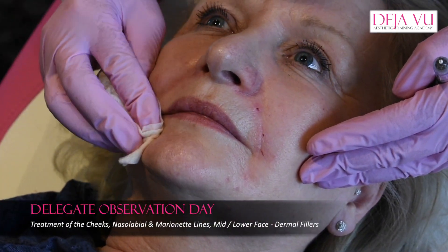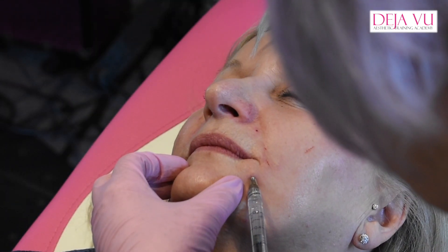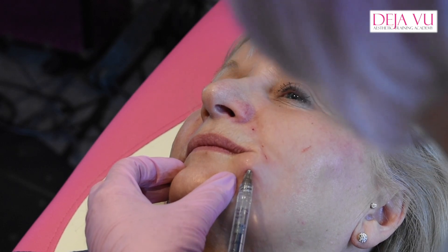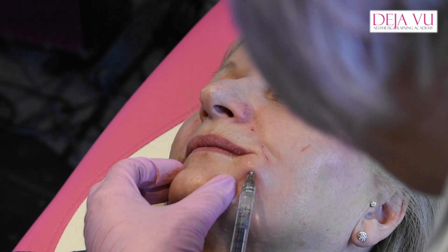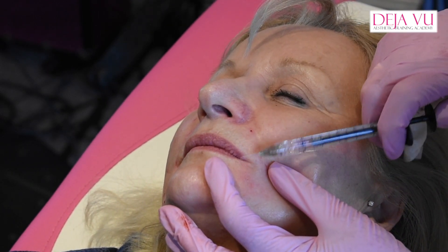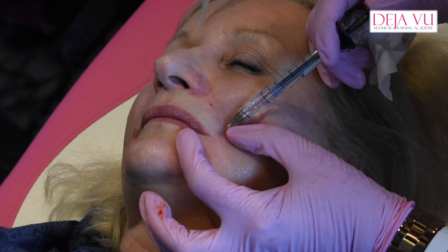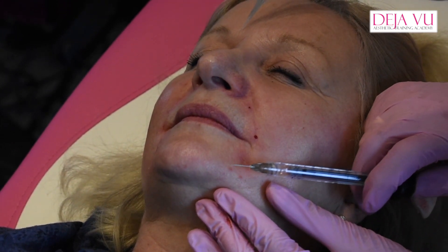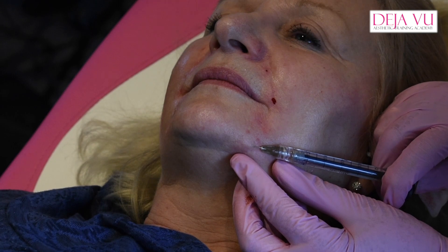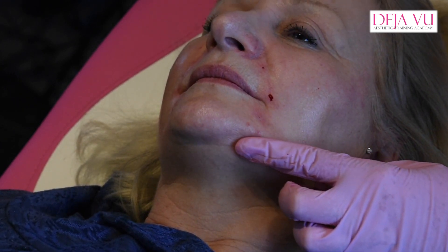Turn it down for me. I can see from this angle that that side's dipping in quite a lot, and this side has come up now. I'm going to put a little bolus there. Come down this way — if you put your finger there, that's where the facial artery is. So I'm going to be going inside of that to make sure I don't hit it. I'm just going to fan just there in the dipping of the jaw. Normally I'd be doing this with a cannula. So all that does is where that little dipping was before, it just smooths it out so it doesn't look like we've got so much of a jowl there.